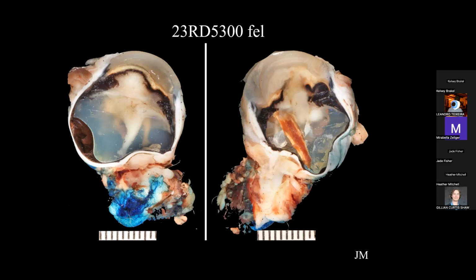So grossly, we've got lens up here, or sorry, cornea up here. But yes, the lens was a little bit unique and weird looking when I sectioned it. I took a picture because instead of a discrete looking lens, there's just this white solid material that has these spikes coming off the back of it. Here, got maybe some detachment or expansion of the suprachoroidal space.